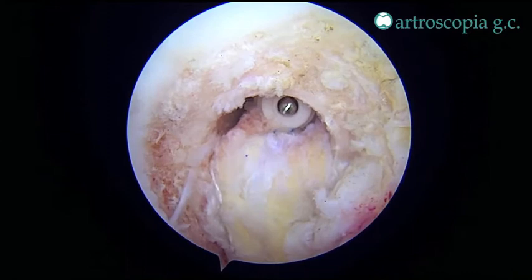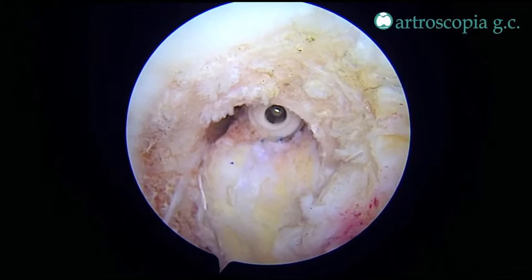An interference screw is used to fix the femoral side outside-in, and then at 60 degrees of flexion, correcting the posterior tibial subluxation, the same fixation is used for the tibia.